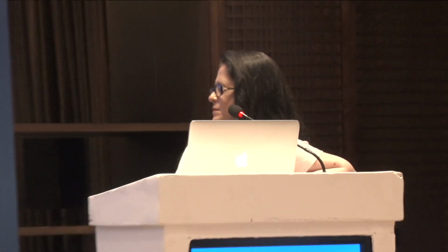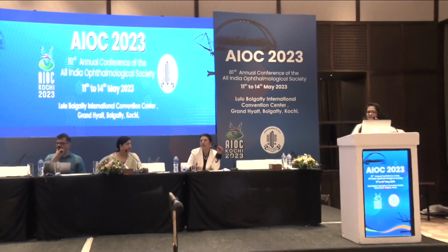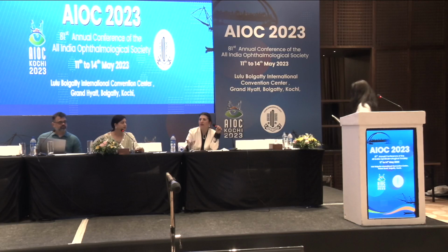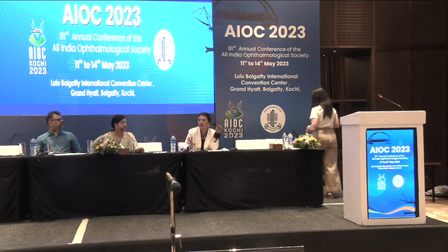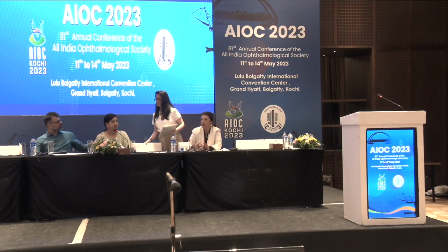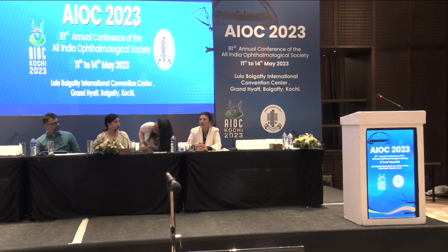Yes, but you can tell them. I don't know how many would, unless you have your own LASIK facility and you're doing a PRK, which is really not costing you much. But if you have to take your patient to another facility, you have to tell the patient that there may be a surprise. And I think with the kind of biometry we do today with our optical biometers and using the latest generation formulas, refractive surprises are quite rare.